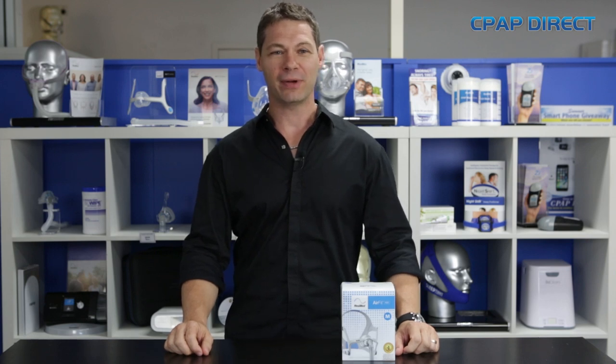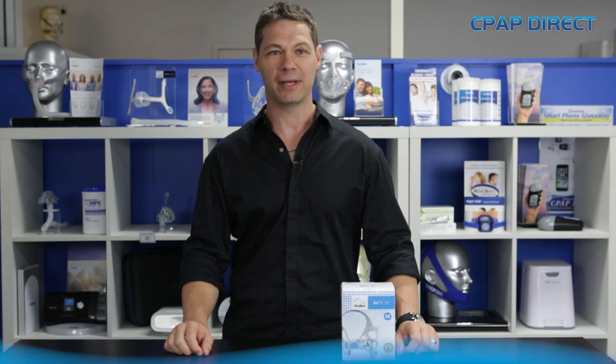Hi, I'm Bryce Perrin from CPAP Direct. In this video, I'm going to cover the new N20 nasal mask by ResMed.